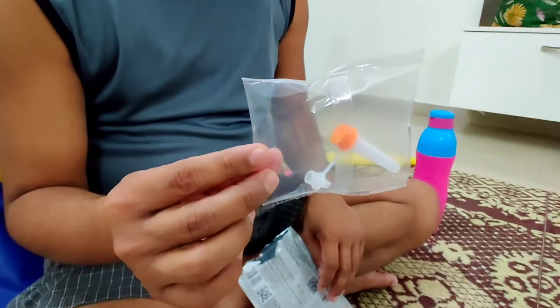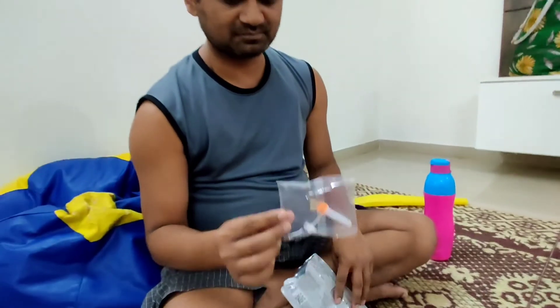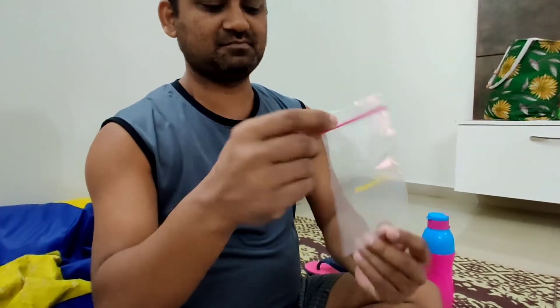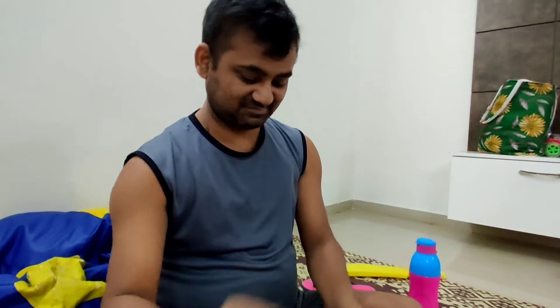You will get the liquid in which you have to dip your swab — it will be a little liquid. This is a disposable bag. After using the kit, you will have to dispose of it.